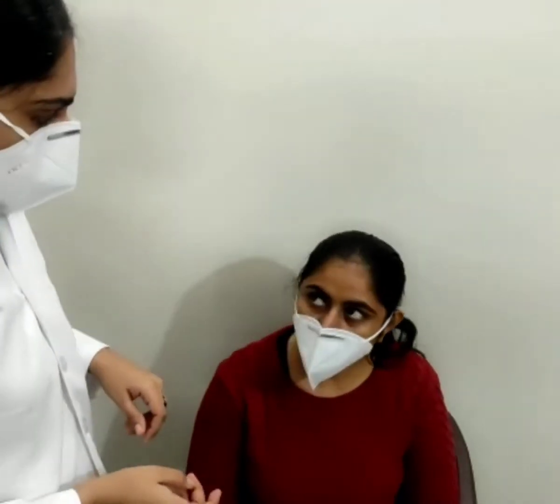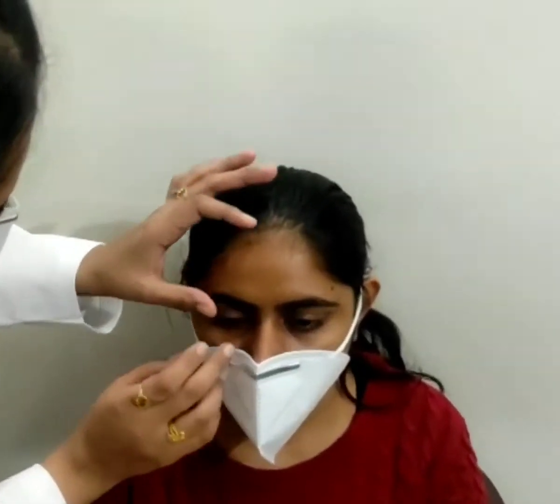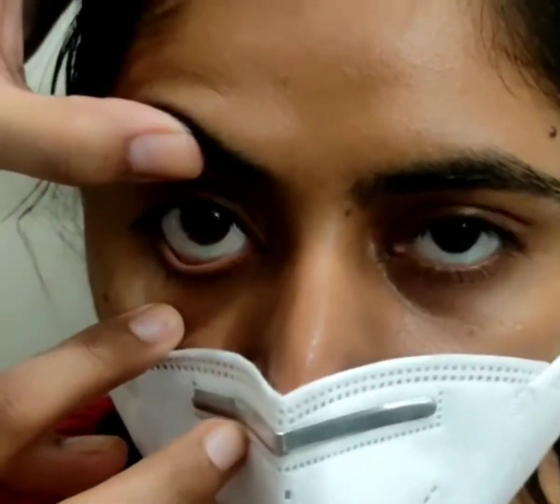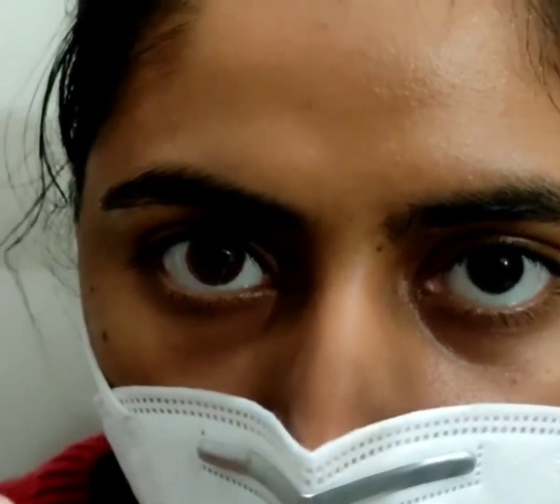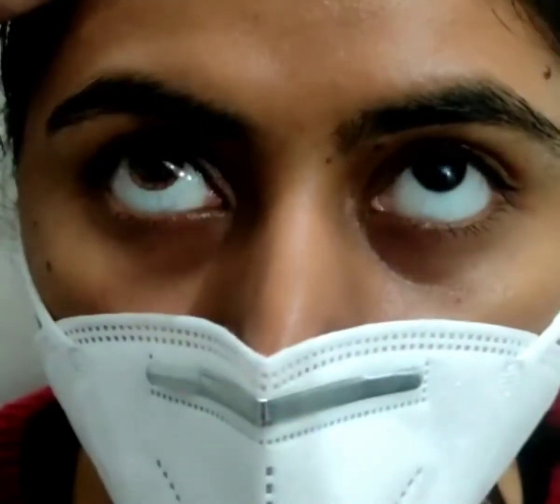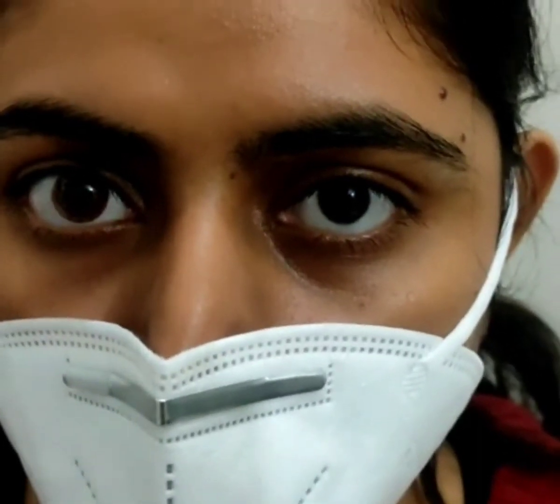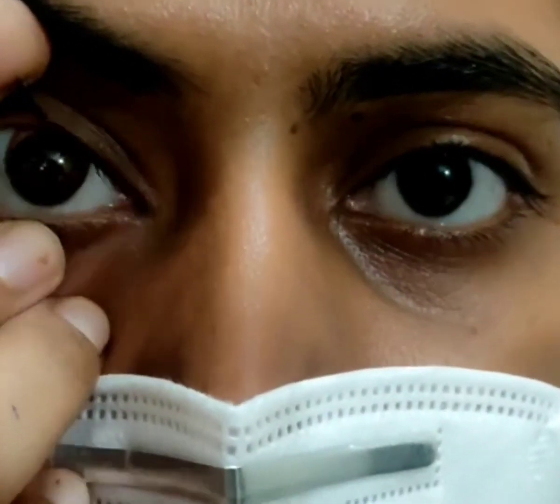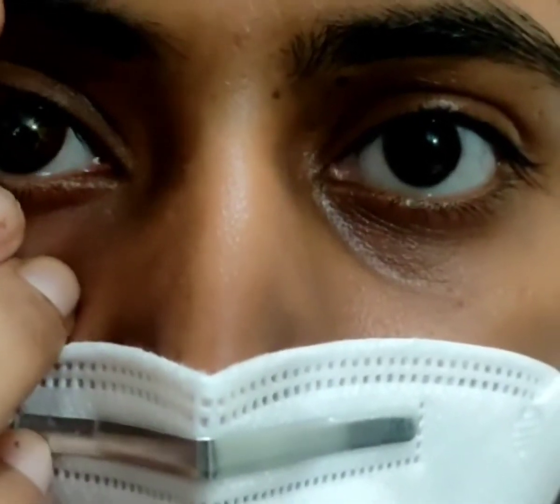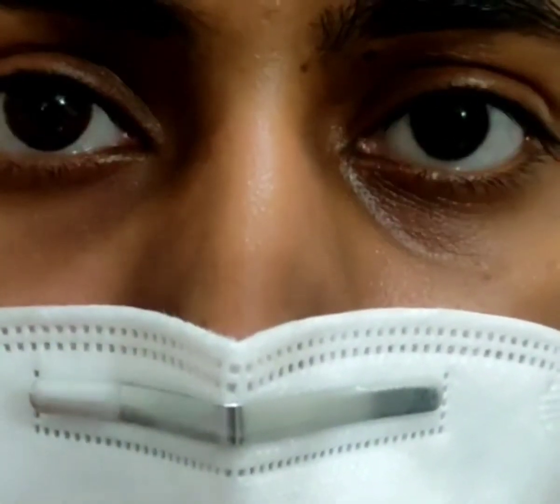The next step is movement and coverage evaluation. Ask the patient if the lens is fairly comfortable. Then check the movement of the soft contact lens. In primary gaze, ask the patient to look straight and blink normally. Check the movement in all gazes — the ideal movement should be 0.2 to 0.4 mm. Move the lens digitally upward and then observe the re-centering. The movement should be smooth and easy. The corneal coverage should be ideal with 1 to 2 mm overlap.